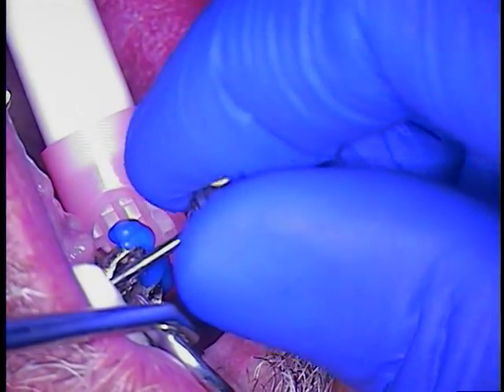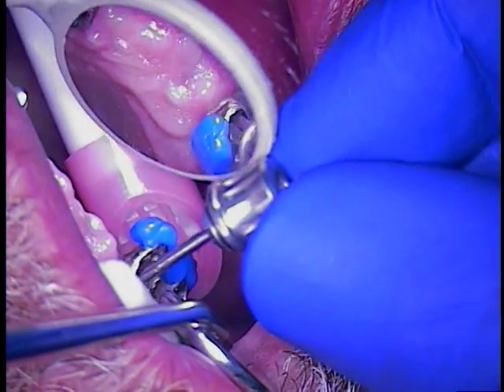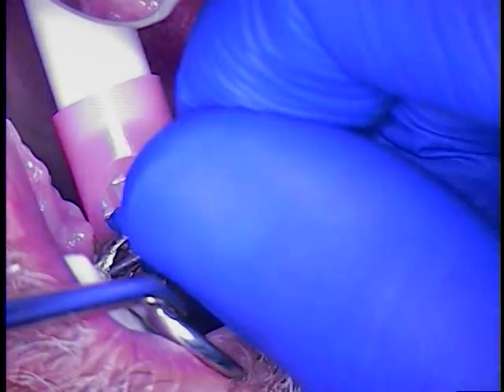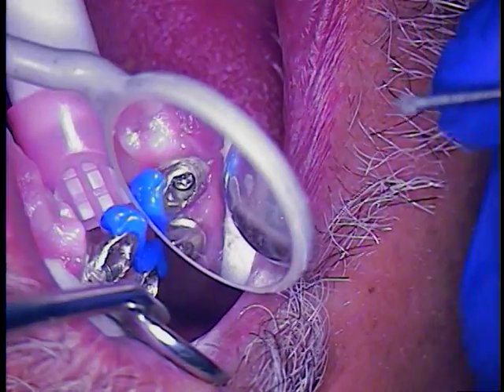So unscrew it, screw it, hand tighten, make sure that the driver is fully seated back and forth, no problem hand tightening that in place.